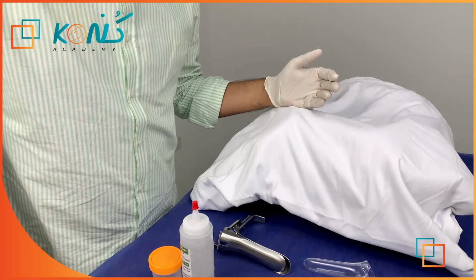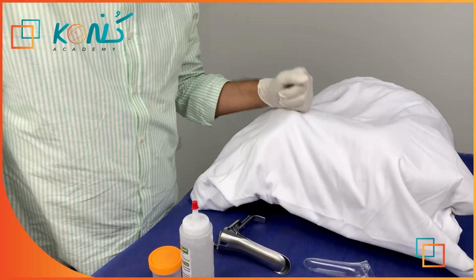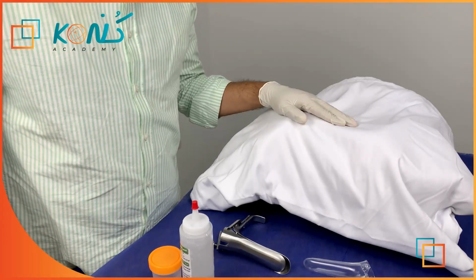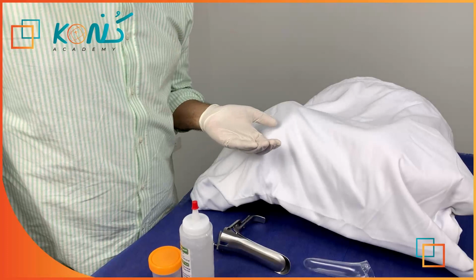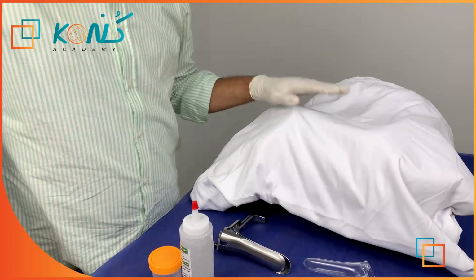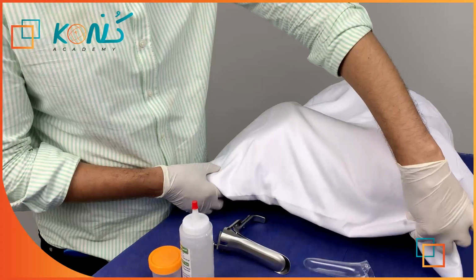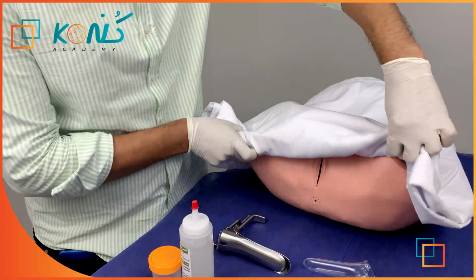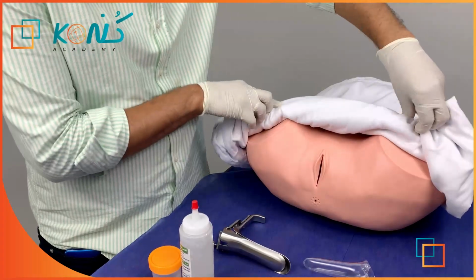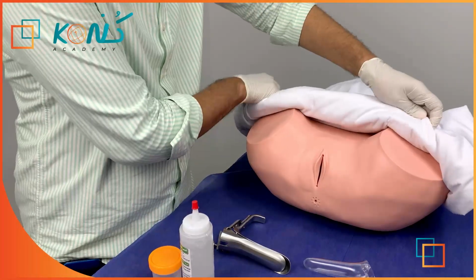Mrs., would you please empty your bladder for me before starting our procedures? Okay. Then you can verbalize that you would ideally also like to wash your hands before wearing the gloves. Then you will start to expose your patient while she is in her modified lithotomy position. Gently like this. You are sitting on the chair right now, and you have a good light source, okay?